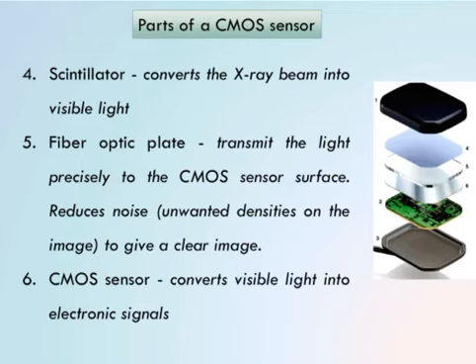So this is called a radiographic noise because it's unwanted. The film should not have anything on its surface apart from the image that can be seen. Okay, so radiographic noise can be removed with the help of this fiber optic plate.